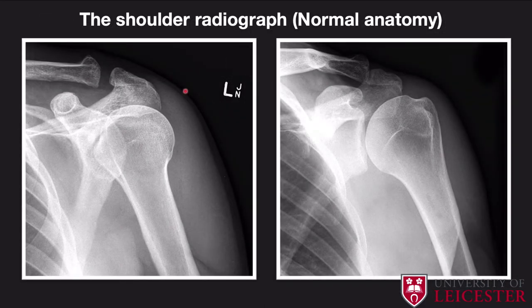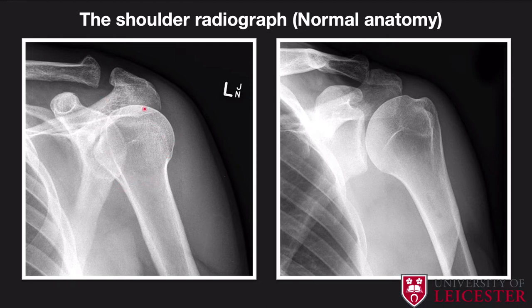One important thing to cover is how the humerus looks when it's internally or externally rotated. Here, compared to the normal neutral position, we've got an internally rotated humerus. You can identify the lesser tuberosity, the greater tuberosity, and the bicipital groove. Classically, this appearance resembles a light bulb. If you see this appearance, you've got to question: has the patient taken the image with internal rotation, or is there suspicion for a posterior shoulder dislocation? That's quite an important thing to bear in mind.